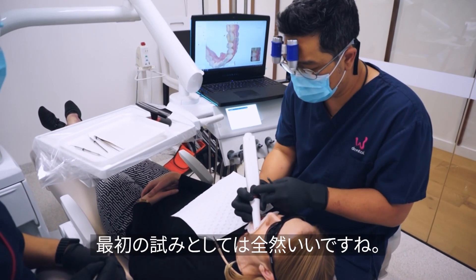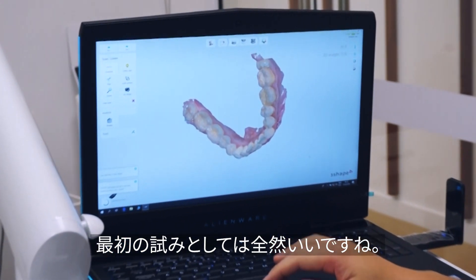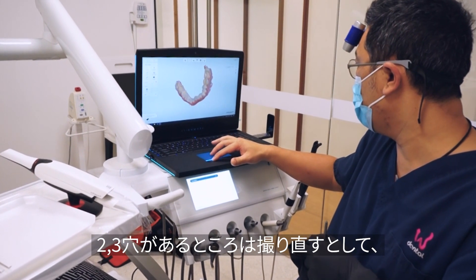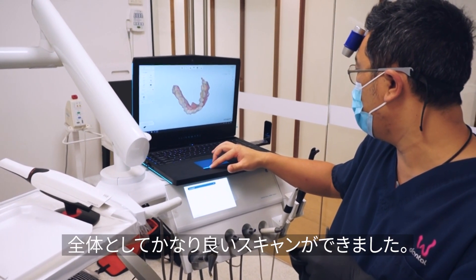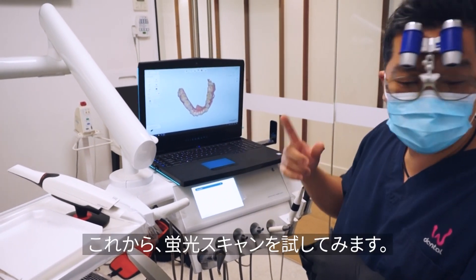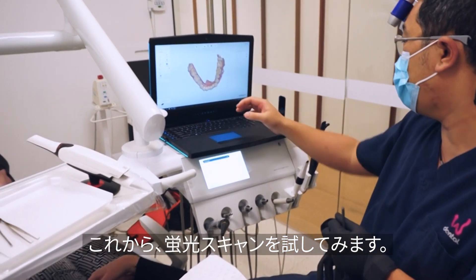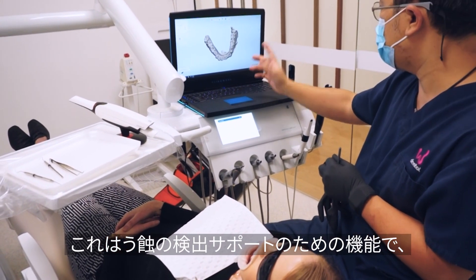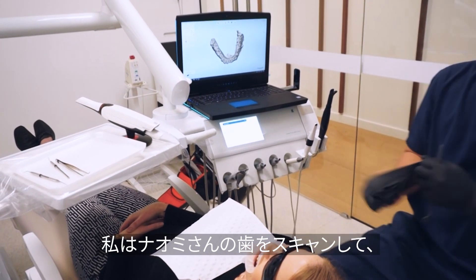Just over a minute — not too bad for our first try. That's a pretty good scan; a couple of holes we can go back through, but generally not a bad scan at all. Now we're going to try the fluorescence filter, which detects caries, and we're going to scan over the existing teeth.